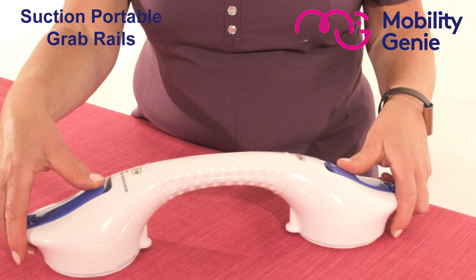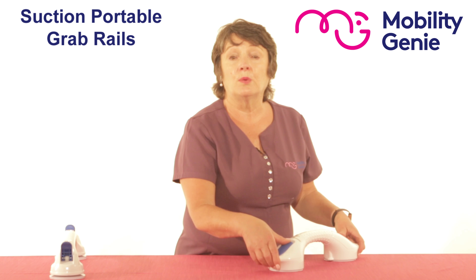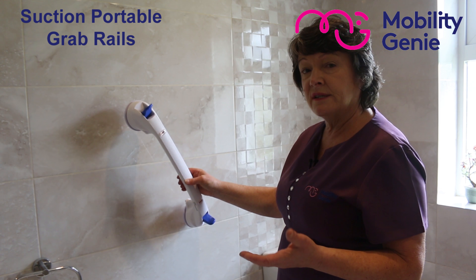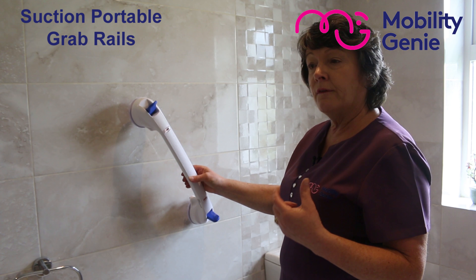Deirdre from Mobility Genie. At Mobility Genie we are often asked for suction grab rails. In general, if it's a long-term situation an occupational therapist will recommend a fitted fixture. But for a situation where you're going to somebody's house and they don't have a grab rail, these are ideal.